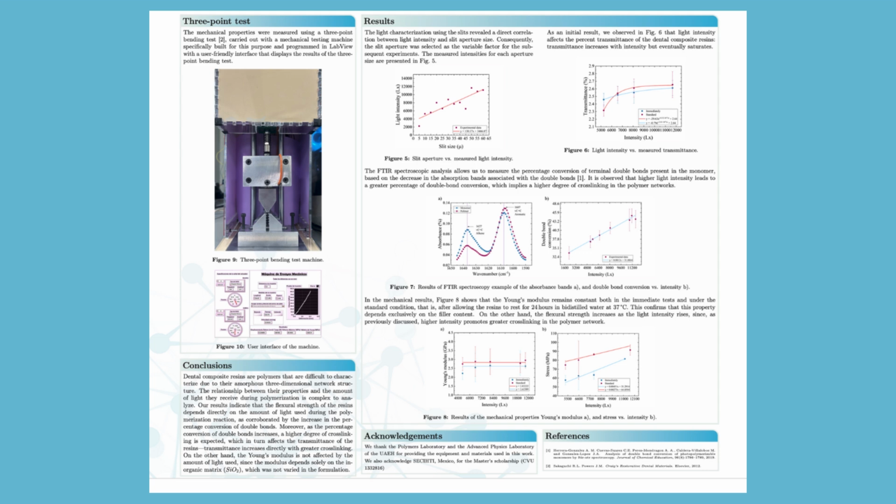In conclusion, we can see the direct effect of light intensity in the double bond conversion percentage and consequently in the flexural stress. To higher intensities, higher flexural stress.